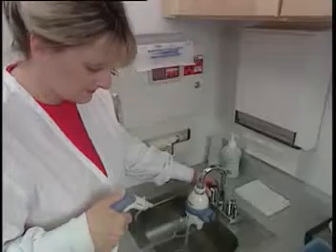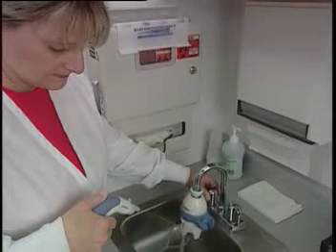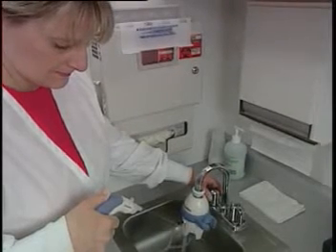You can maintain some control over the flow rate by adjusting your force on the actuator. Check the temperature of the irrigating water by looking at the handle's thermal sensor while depressing the water flow actuator. The water temperature sensor will be blue if the water is too cold. When the water is within normal limits for safe and effective irrigation, the sensor will turn white, indicating that it's safe to begin the procedure.